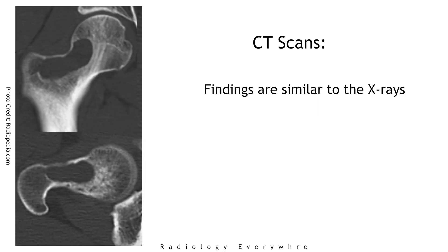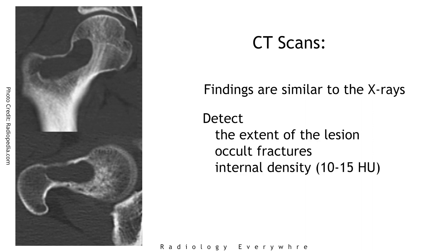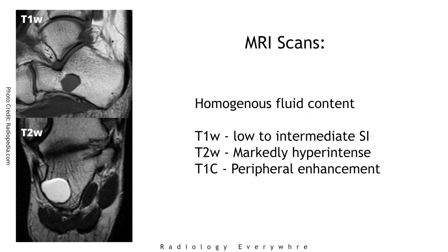CT findings are very similar to the x-rays. The main advantage is that you can characterize the extent, detect occult fractures, and assess the internal density, which is usually between 10 to 15 Hounsfield units.